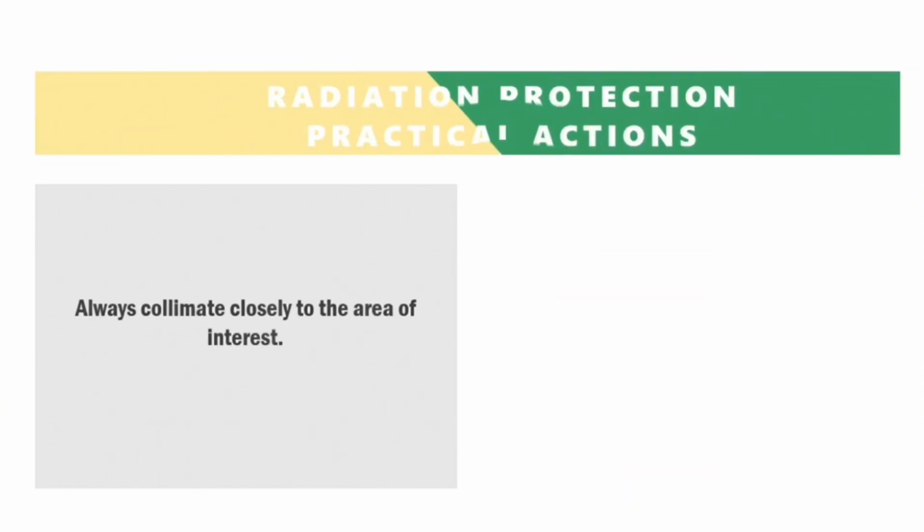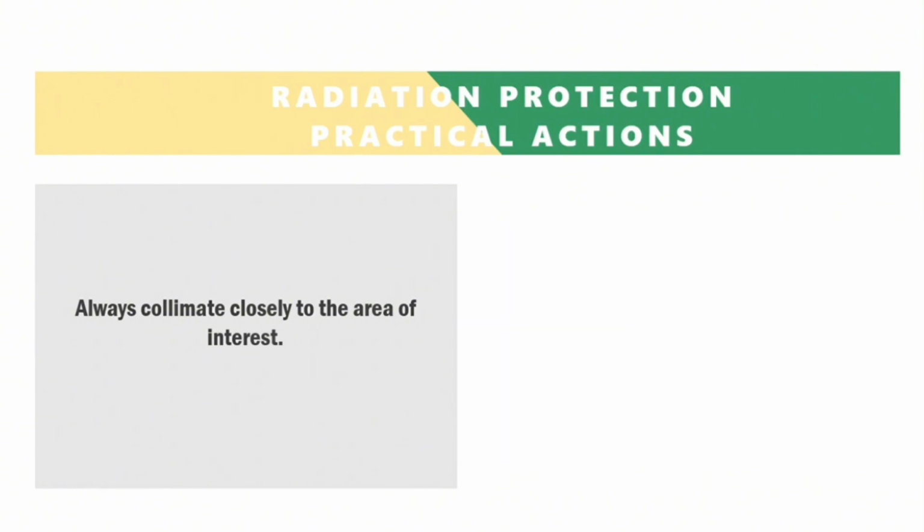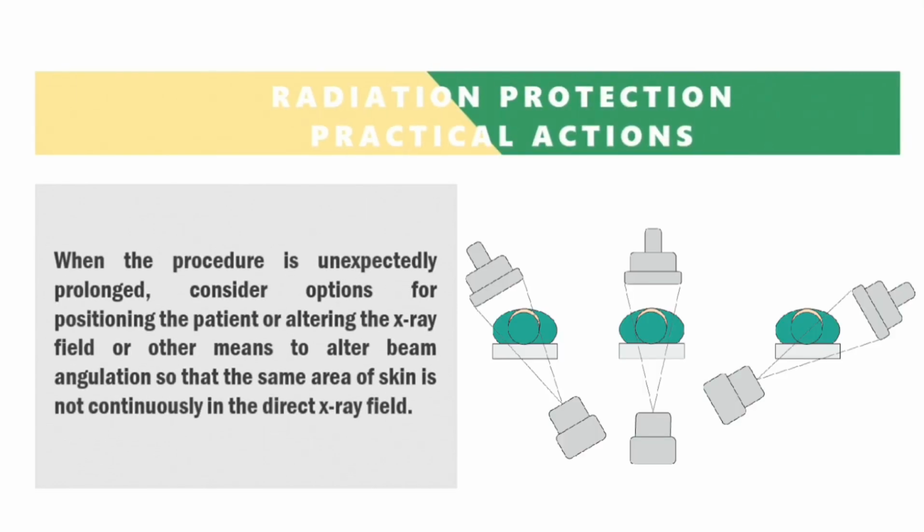And always collimate closely to the area of interest, because this precision minimizes unnecessary exposure to the surrounding tissues. In case a procedure unexpectedly prolongs, we explore options to reposition the patient or alter the X-ray field, avoiding continuous exposure to the same skin area.